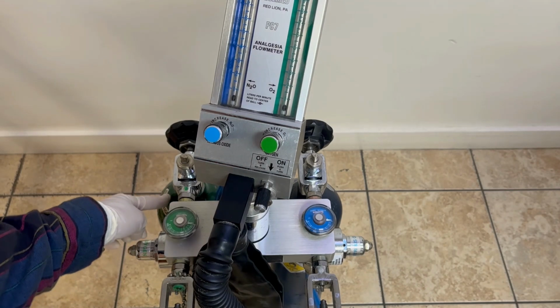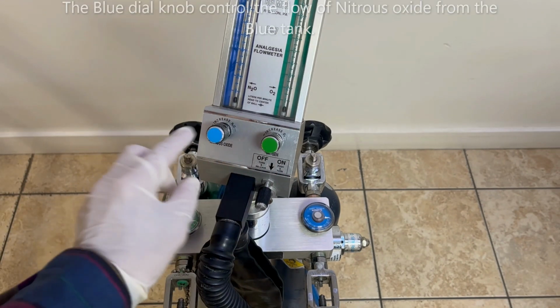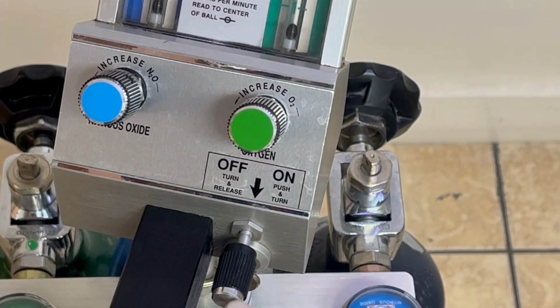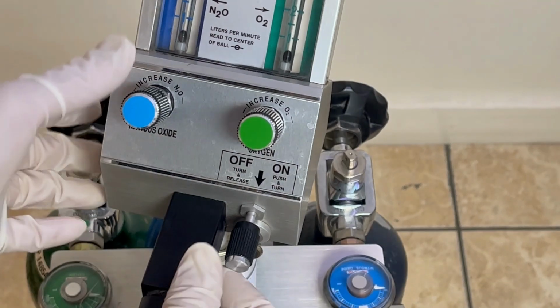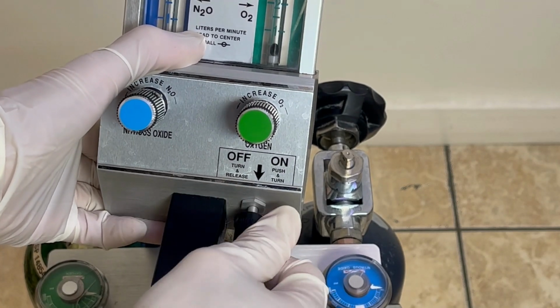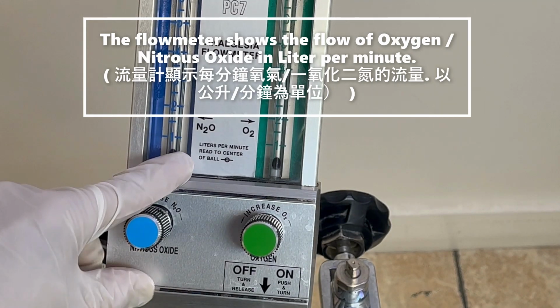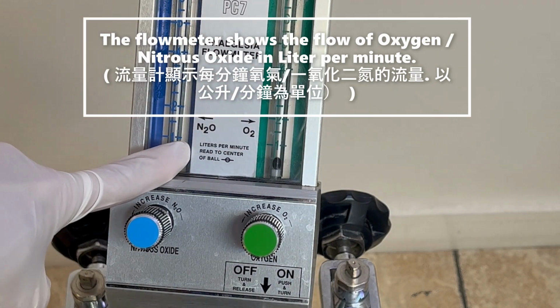The green tank in the mobile unit is for the oxygen, which is controlled by the green button. The blue buttons control the flow of the nitrous oxide from the blue tank. There's a main on and off switch here. When you turn it on, you press the button, push it in and turn it clockwise like this to lock it. This is a liter. Each interval is a liter. This will show you the flow of oxygen per minute. This is liters per minute.